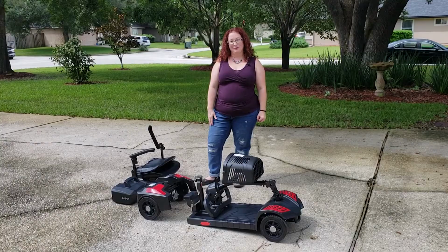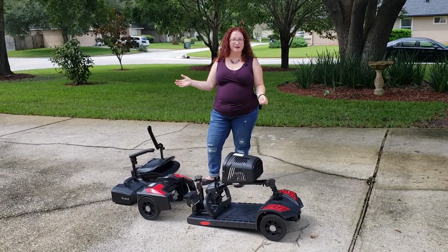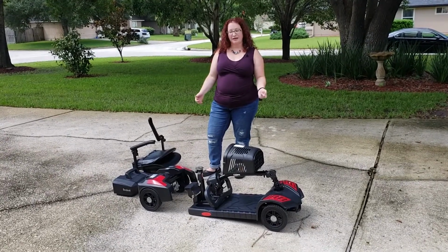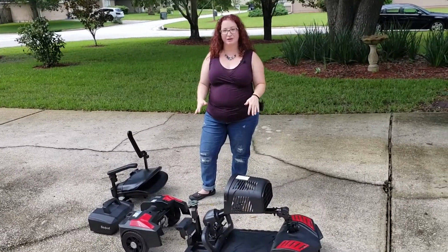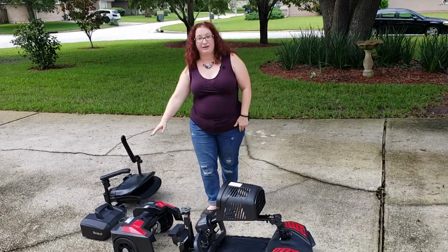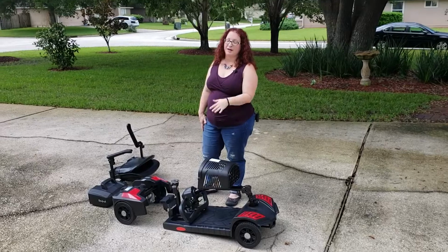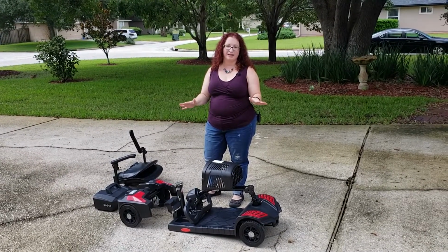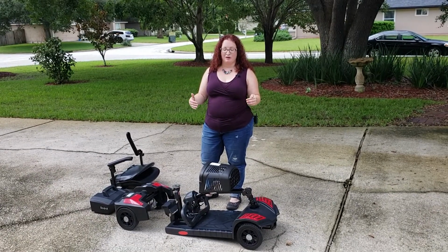Today we're going to talk about putting your scooter back together. I just got back from going to the park and having a ride on my scooter, and I took it out of my car and all the pieces are here laid out. So I just want to show you how to put it back together so that you can be back to riding. You can see that I have it in 4 parts. It could be 5 parts if I took this basket off. I find it easier to not do that if I don't have to. If it fits in my car with the basket on, I just leave it there. It's just one less piece for me to put on.